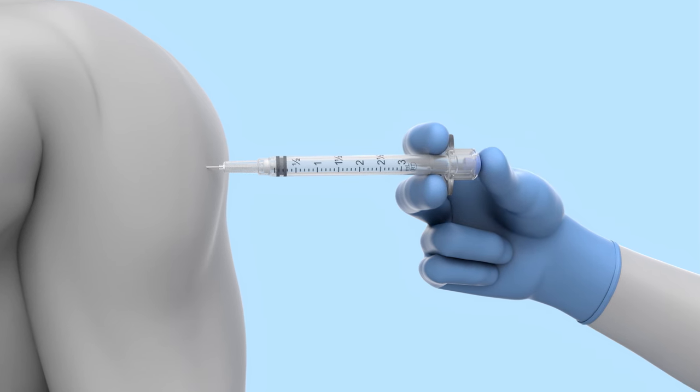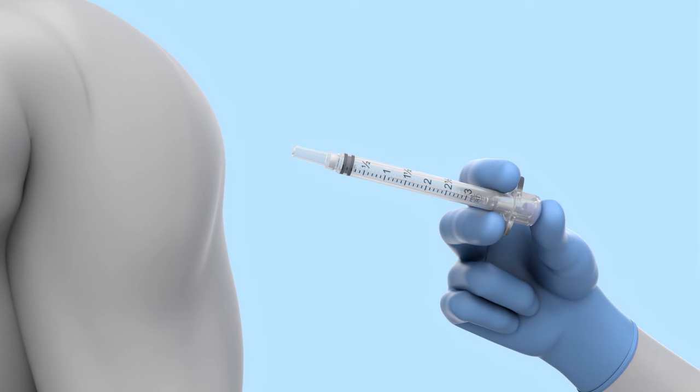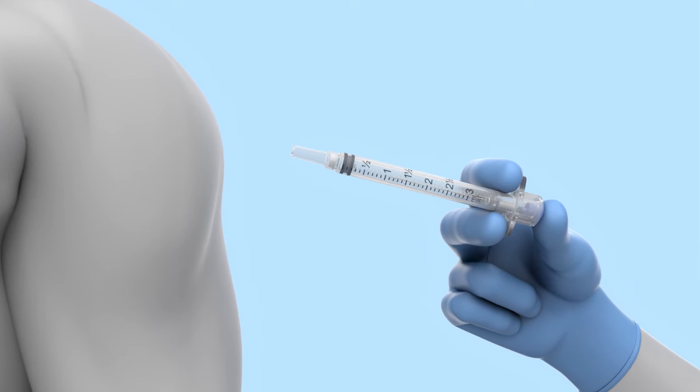Squeeze through the resistance point to deliver the full medication dose. The needle will retract directly from the patient into the barrel of the syringe.